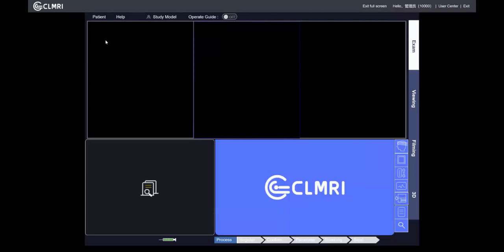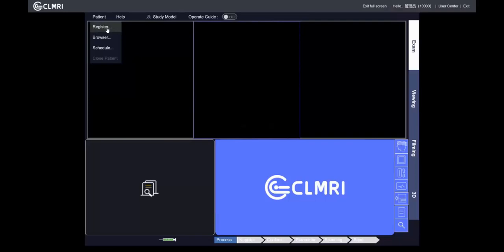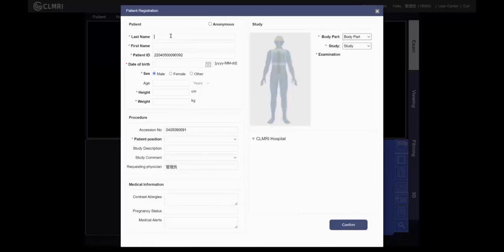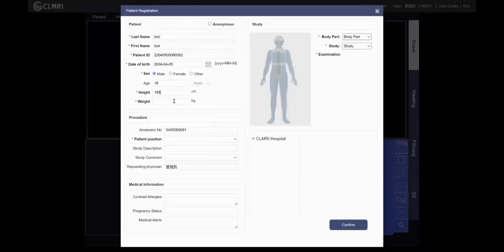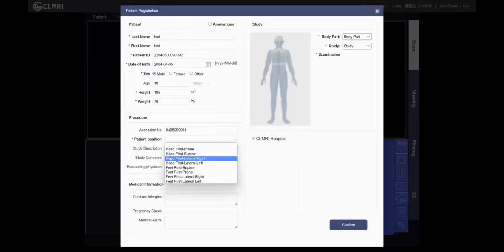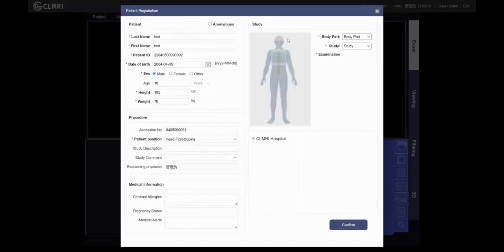I want to show you the brain scan demo. First, we need to register a new patient. Input the last name and first name. Also input the patient ID, the date of birth, and the height. Of course we must also choose the sex — male or female. Then we select the patient position. For a brain scan, we should put the patient head-first supine. Then select the examination study.